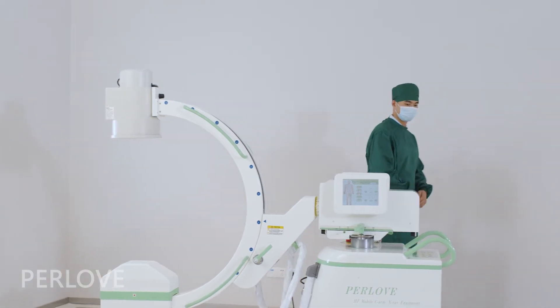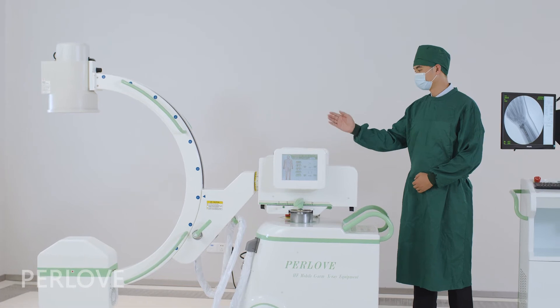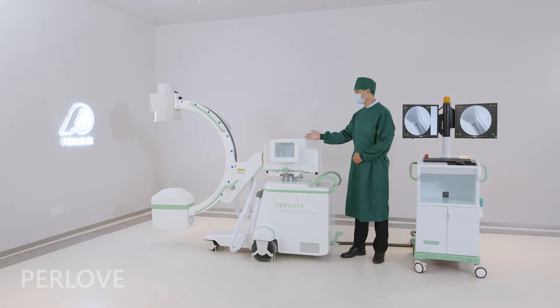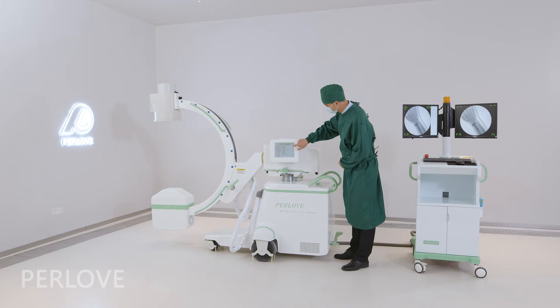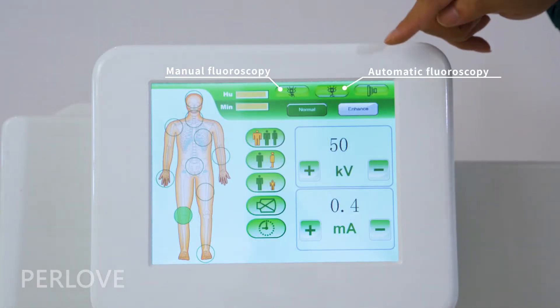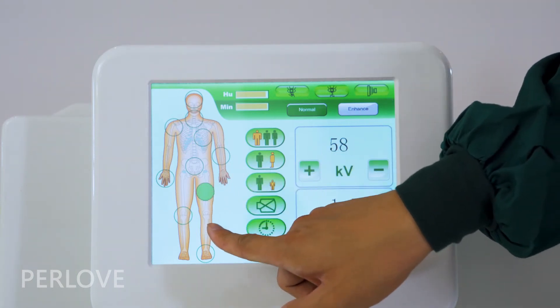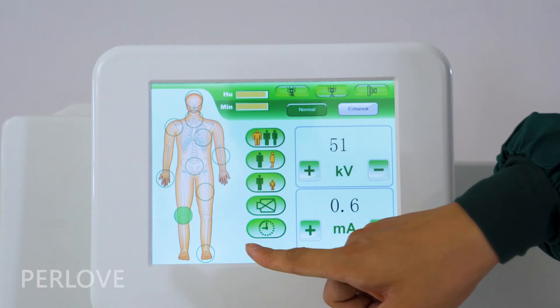The PLX-7000A has two human body graphic LCD touch panels. The control panel has three modes for operation: manual fluoroscopy, automatic fluoroscopy, and radiography. It can help the operator to set parameters quickly.